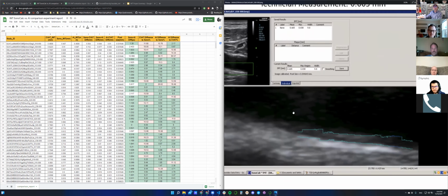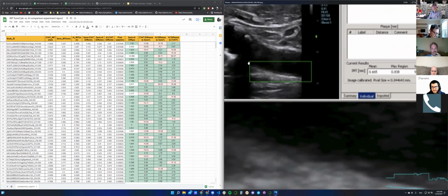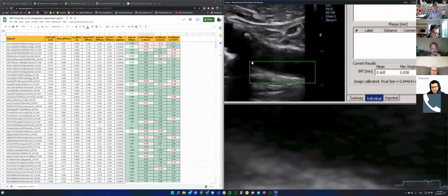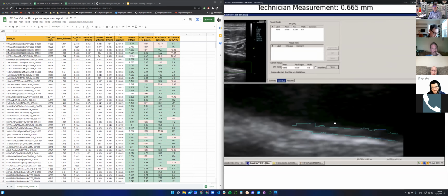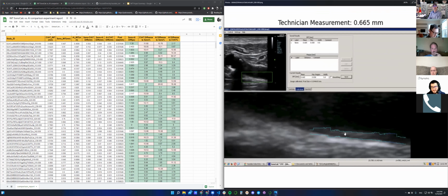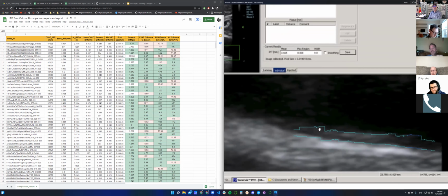it's not always easy. Well, my guess is that the 10 millimeter distance is this green box. So I think this is 10 millimeters. For example, in that case, I think this is not 10 millimeters of IMT. I can almost say that. And I think that box is just the region of interest.